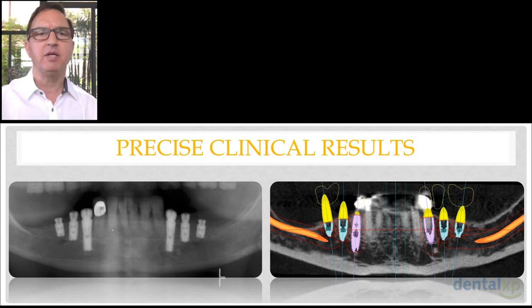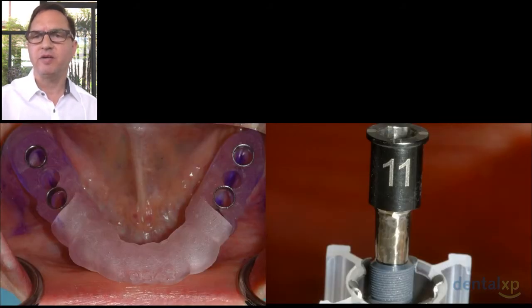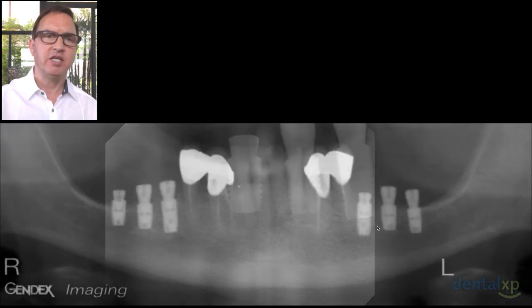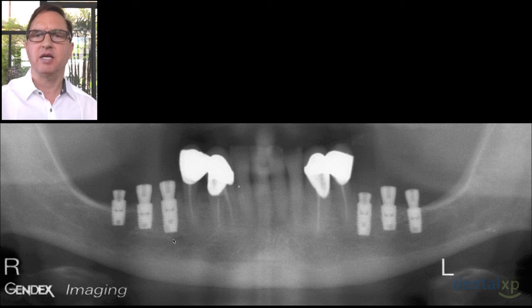Another example of the same, limited vertical height over the mandibular canal. Multiple implants are being planned. We have modified the drill holder, the fixture holder, to be smaller in diameter than the final burr that's utilized, and that enables us to place either supracrestal, equicrestal, or subcrestal that we might accomplish in a narrow ridge to cover the buccal threads of the implant. And once again, this implant was intentionally placed shallow to avoid trauma to the mandibular canal and the mandibular nerve that's resting inside of that.